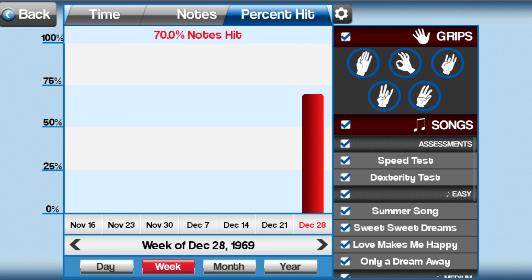Select the gear icon to bring up the Options panel. Here you can see specific trends for a specific grip or song.